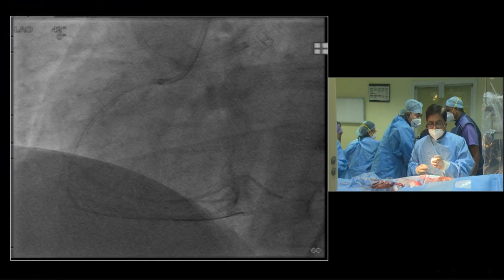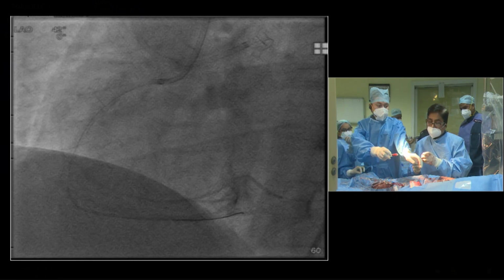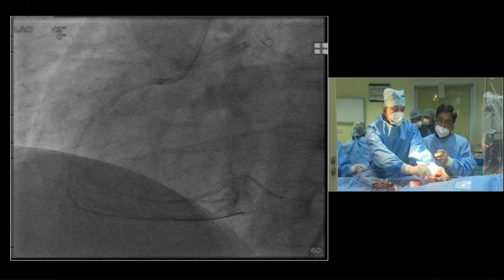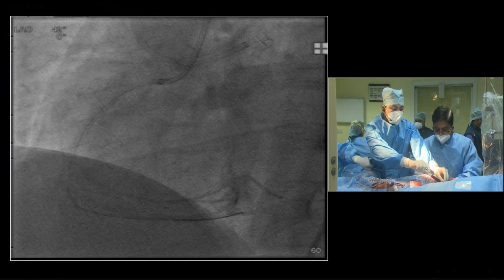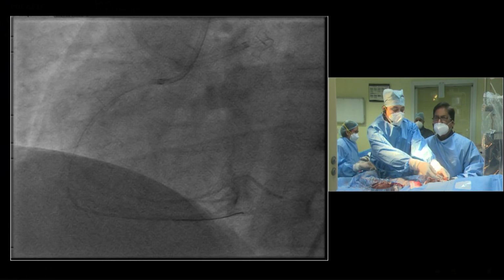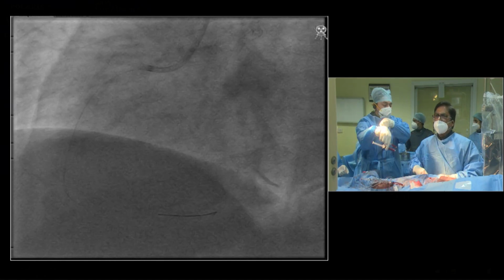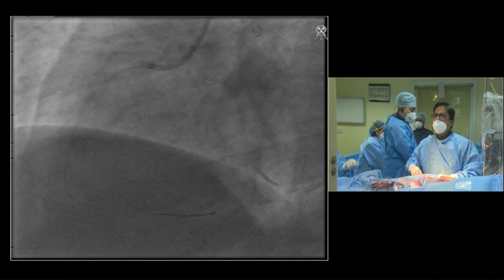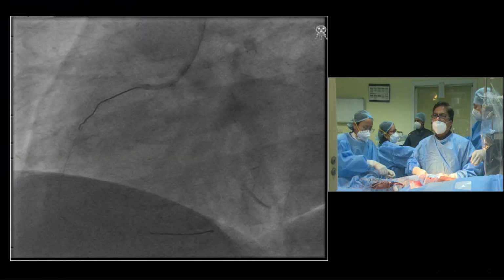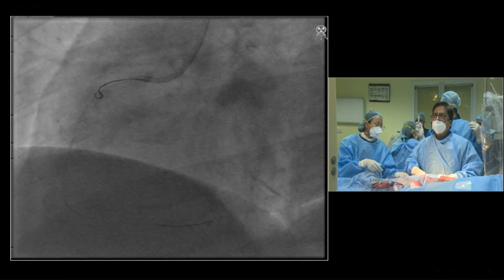Give him some fluid. Actually, his BP looks a little low to me, not sure why. I think you can remove the RCA left catheter. I have removed them. Leave it please. Why this is important in these cases, you know? Heparin is given properly. Dr. Goel sir, you can check whether heparin is given correctly. Yes sir, we have checked the ACT.